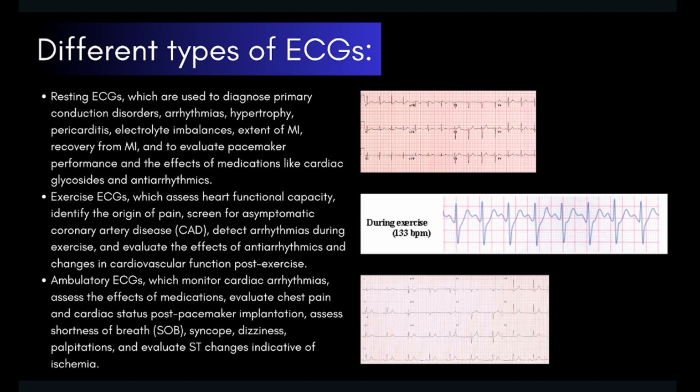Exercise ECGs, which assess heart functional capacity, identify the origin of pain, screen for asymptomatic coronary artery disease, also known as CAD, detect arrhythmias during exercise, and evaluate the effects of antiarrhythmics and changes in cardiovascular function post-exercise.